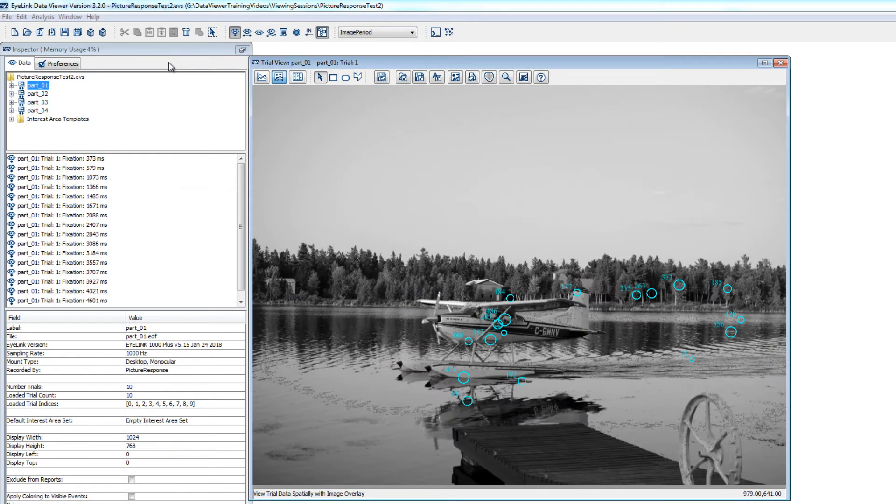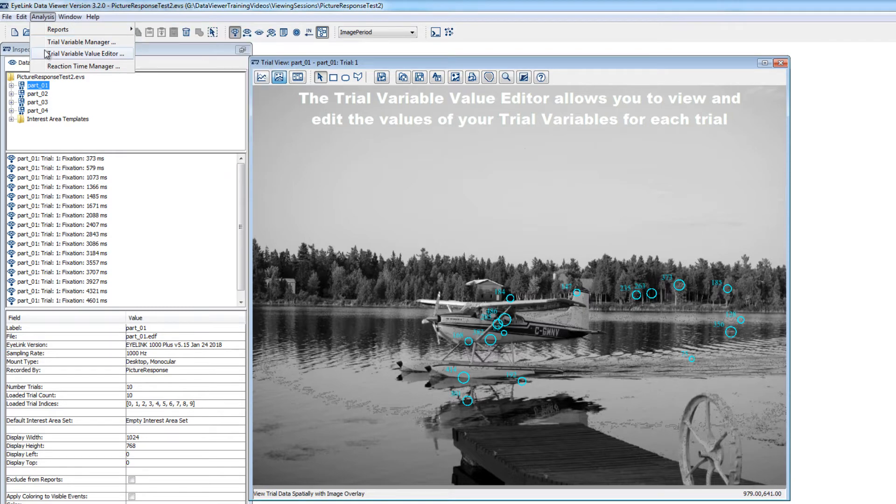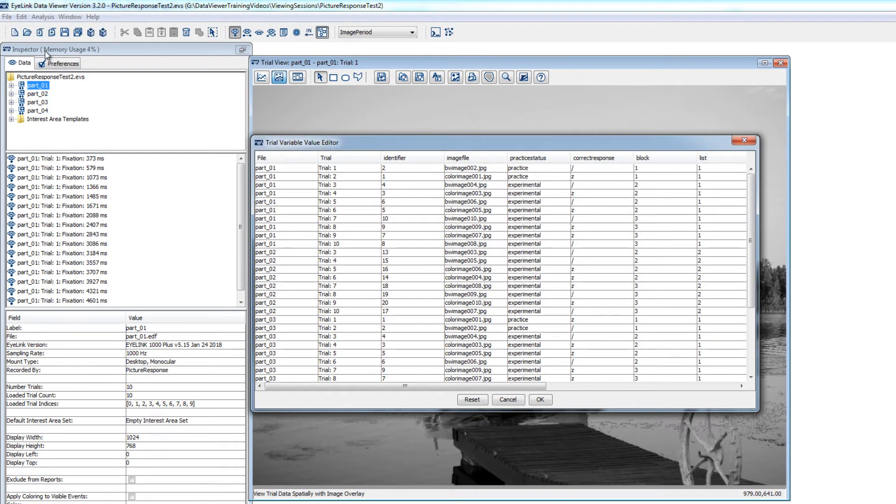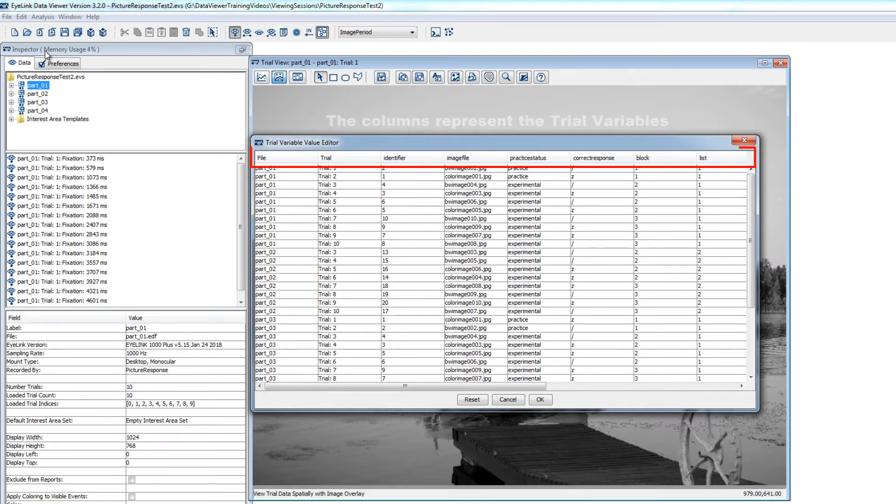If you want to check the values of your trial variables for the various participants and trials in your viewing session, you can use the Trial Variable Value Editor, which can be accessed from the Analysis menu. The rows of the Trial Variable Value Editor represent the trials of the viewing session, and the columns are the trial variables.